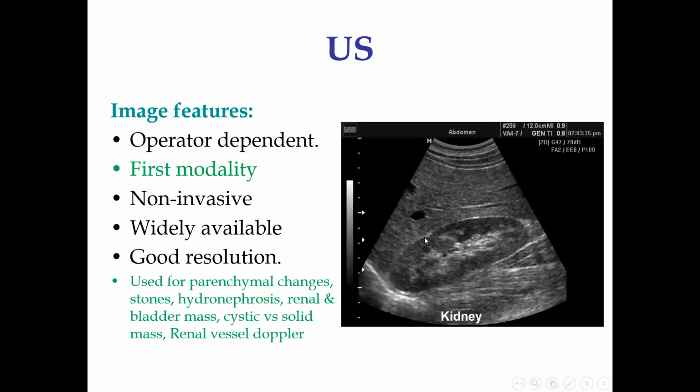This is how the kidney looks on ultrasound. This is the adjacent liver. Now, if you compare it with the liver, the echogenicity or the appearance of the cortex is darker as compared to the liver. And why is this area brighter? Why is the medulla brighter here? Why is the cortex black? Anyone? What structure makes it brighter in the center? Fat. Okay. So it's sinus fat. This is the fat inside the medullary region. That is why it is brighter here. Okay.